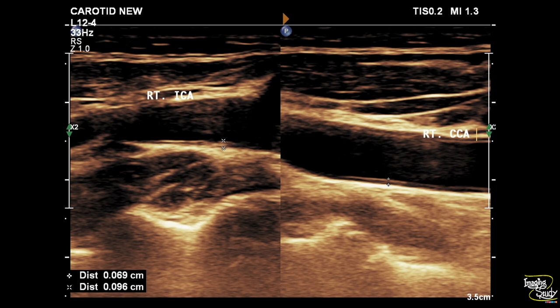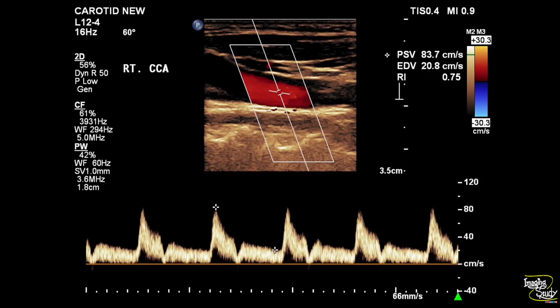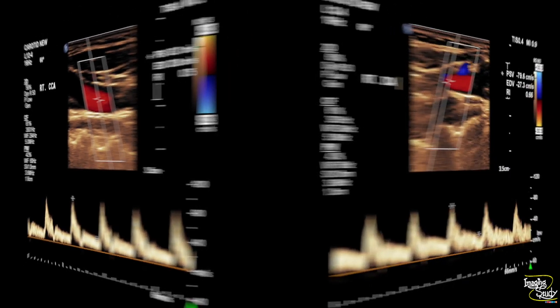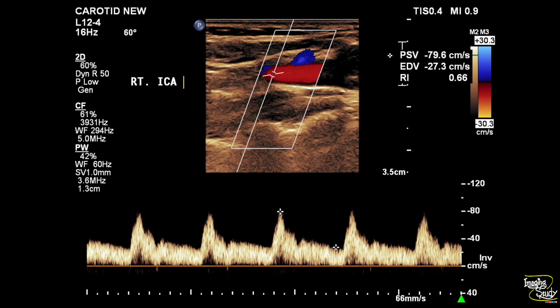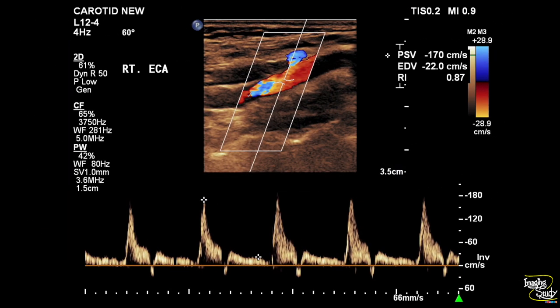Let's check the spectrum. This is the right common carotid artery, which is showing a good amount of flow with a normal spectral pattern. This is the right internal carotid artery, which shows a normal flow velocity. This is the right external carotid artery, which shows slightly increased velocity.